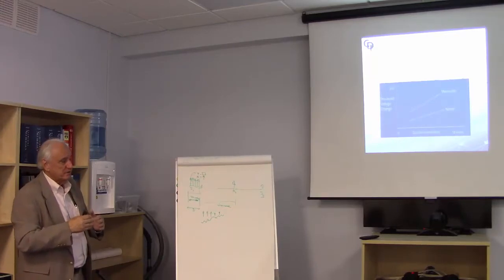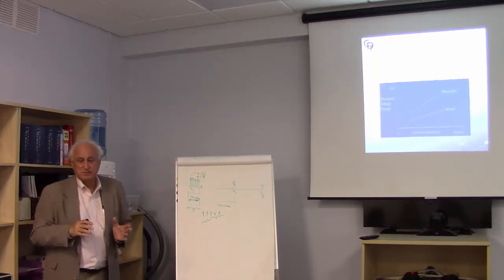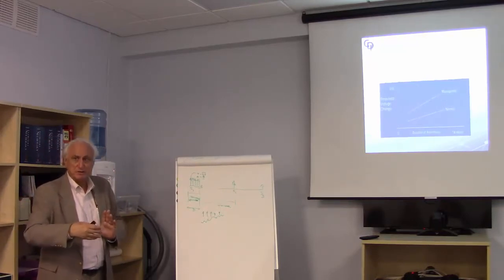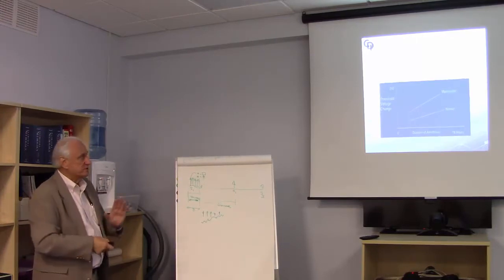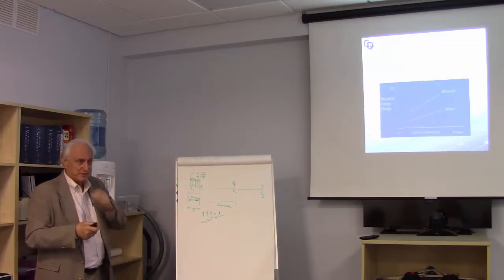So this to me is always a dilemma. This phenomenon is going on. If an operation is going to go on 6, 7, 8 hours, which is not unusual, you're going to expect to see this accumulative effect of anesthesia.